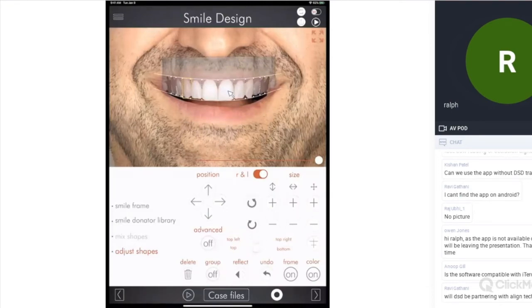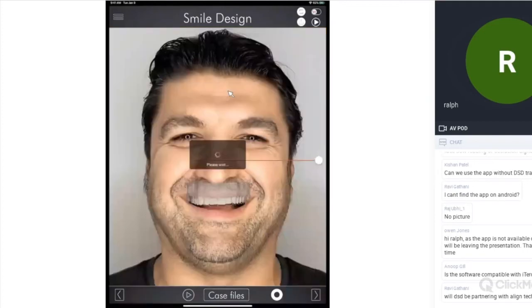I'm 9 minutes in the planning, so I need to be here more. It's fine. I'm going to reflect on the other side. And here we go. Okay, so that's my smile. Smile simulation. I'm going to follow very precisely my outlines. That's the idea of the design and the technology that we develop. So 2D is fine.